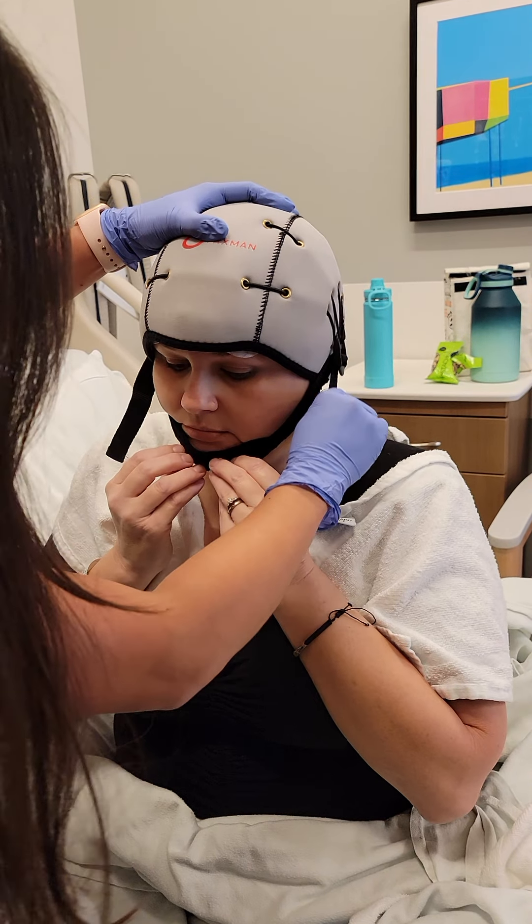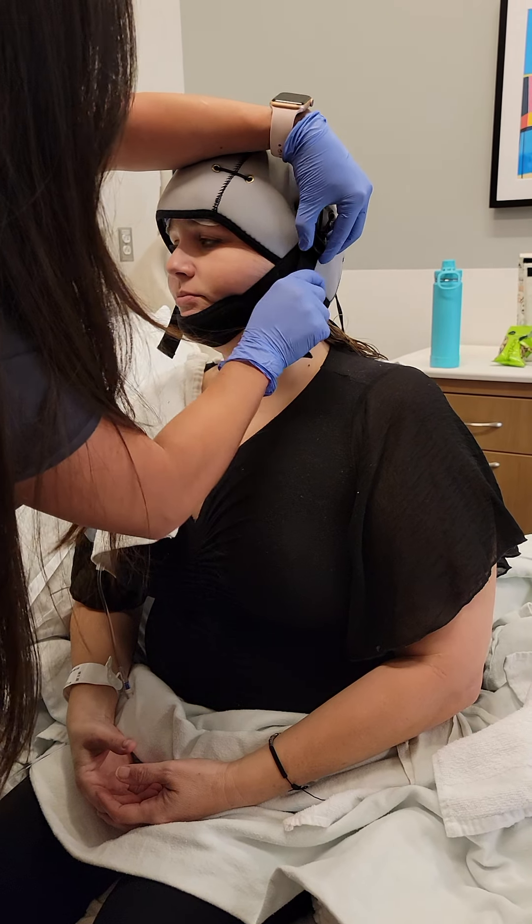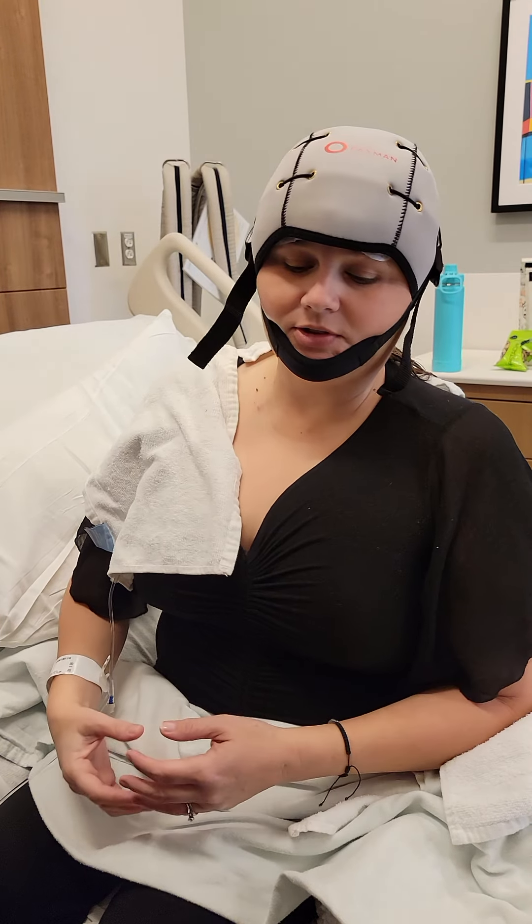As long as you can say 'ah' and you can talk and eat, you're fine. It feels good — I want it tight, I want it to be on there good. You want it tighter or is this good? I think it feels good. I just don't mind it being tighter because I want it to make good contact everywhere. If it can get a little tighter, it would be better. I'd rather be safe than sorry. It looks good.